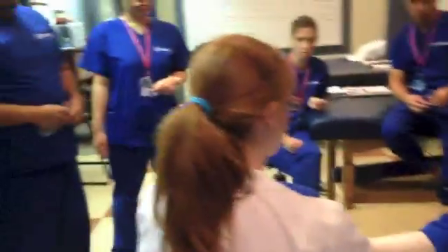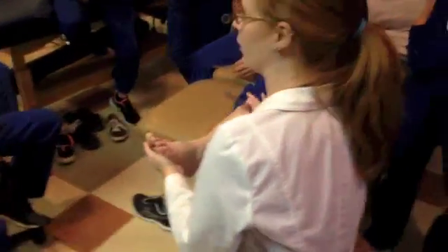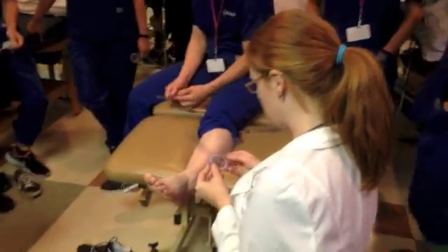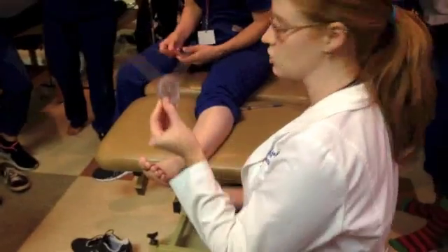On your lab, it specifies what knee position you want to have your patient in. For right now, I'm just going to show you everything with knee extension. So for dorsiflexion and plantarflexion, our zero starts at 90.